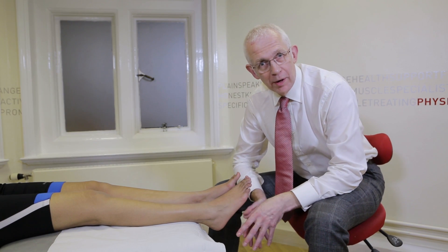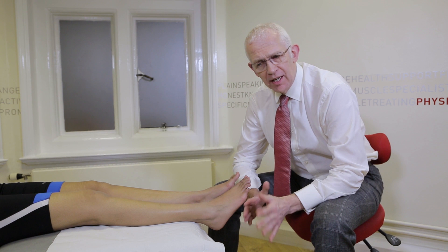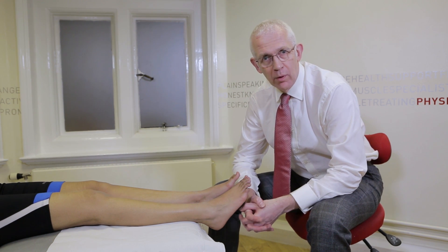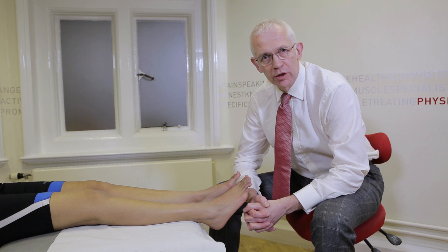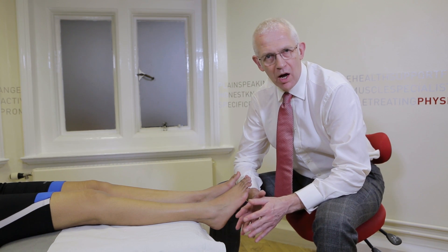My name is Trevor Prime, a consultant podiatric surgeon, and the aim of this video is to cover some of the principles for taking a cast. When we want to make a precision orthosis, a custom orthosis such as PodFo, we need to get an accurate impression of the foot. One of the secrets is to try and make that as repeatable and as reliable as possible.